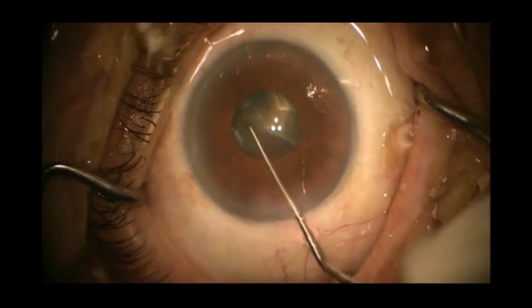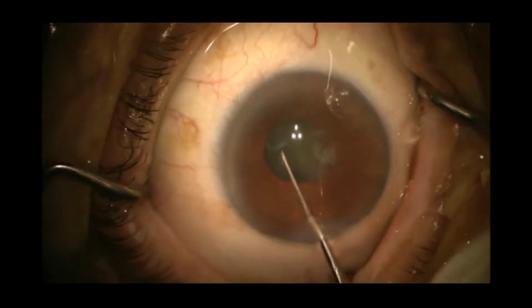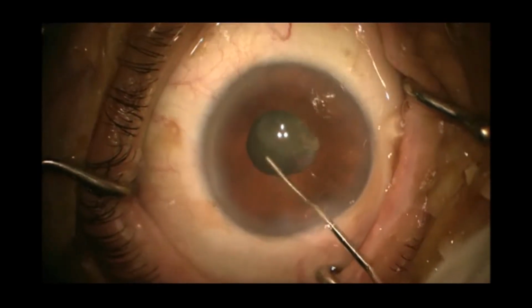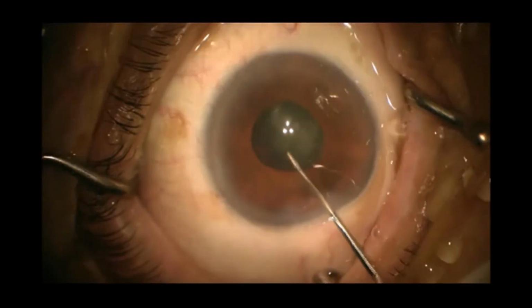Now I'm left with this epinuclear bowl and I'm scared to go and flip it with my phaco tip. So I inject some viscoelastic and with the Sinskey I just elevate it out of the bag.